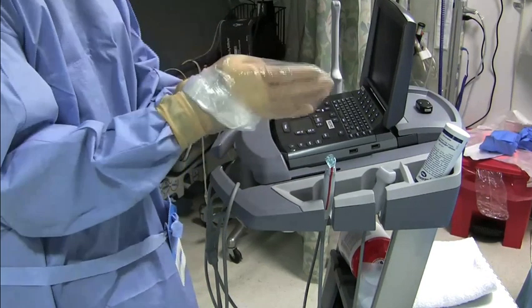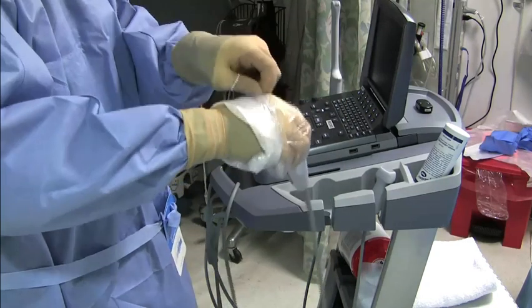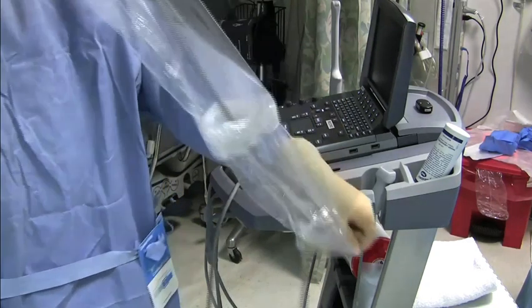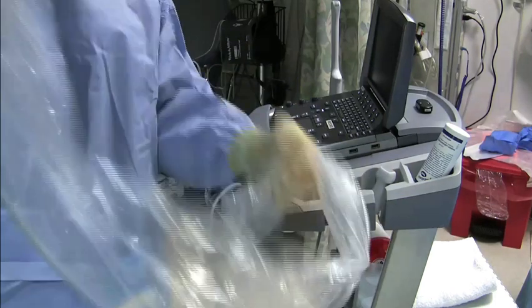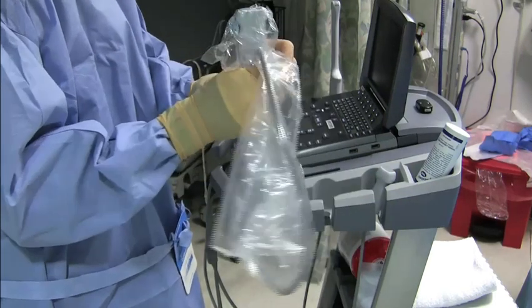You can see the sheath is now on your hand like a glove. You will grab the transducer, grab the edge of the sheath and unfurl it over the transducer and cord much like a sock. Be sure to control the transducer cable and the sheath in order to not contaminate yourself or the field.